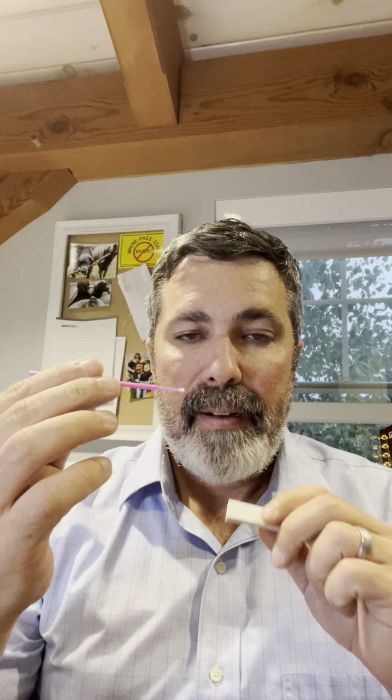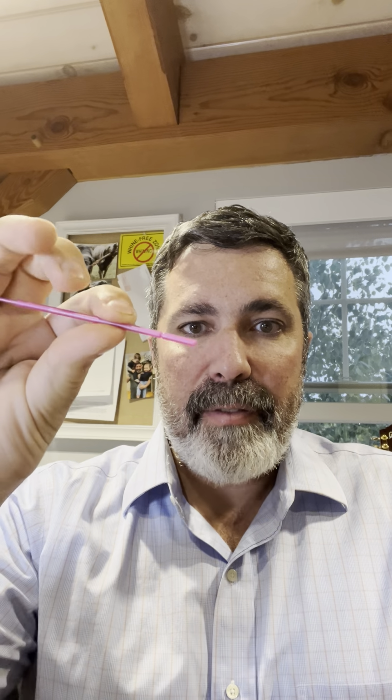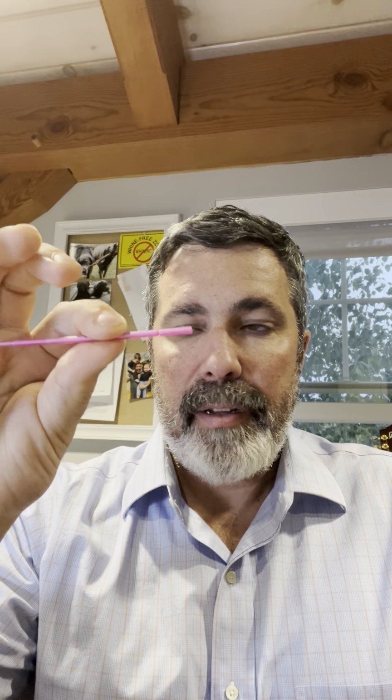It'd be better to go a little bit bigger, but if a patient has a very significant deep bite, class 2 patients, you might want to use something like a cotton stick applicator or a bonding brush, something to that effect, because 4 millimeters in the back might actually just be a little bit in the front. At minimum, we at least want to have a millimeter in the front, okay?